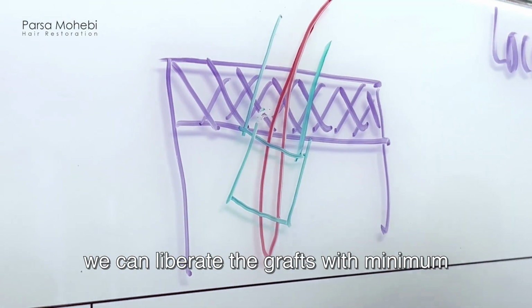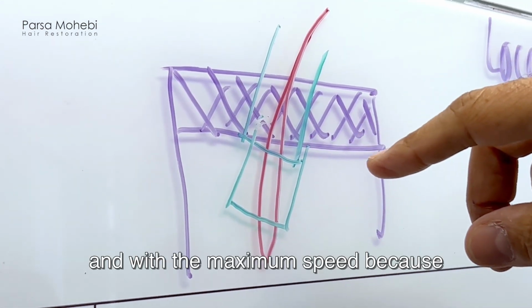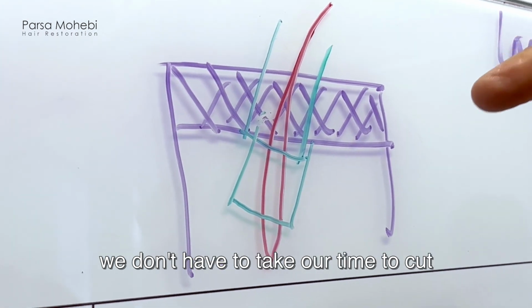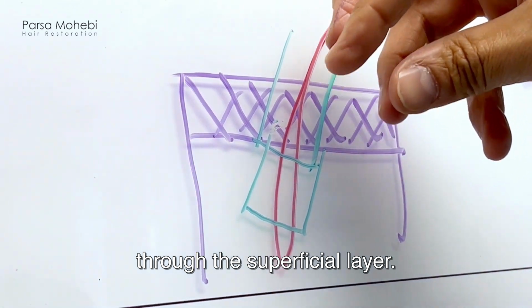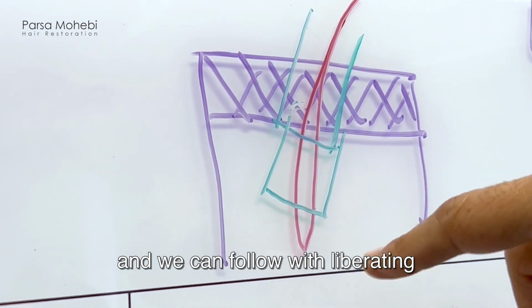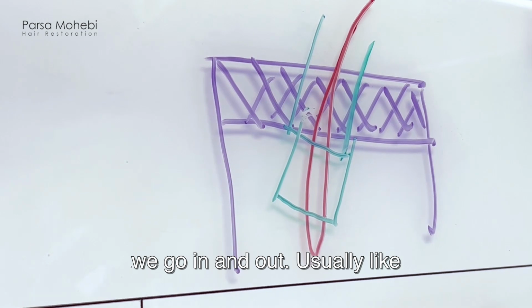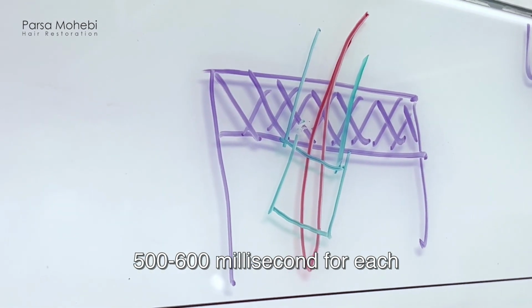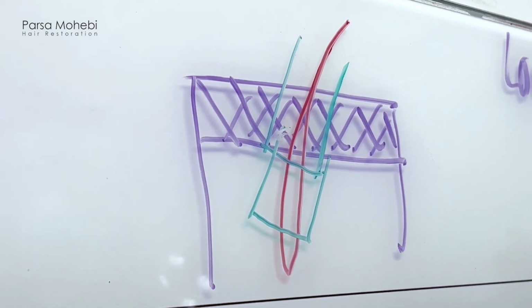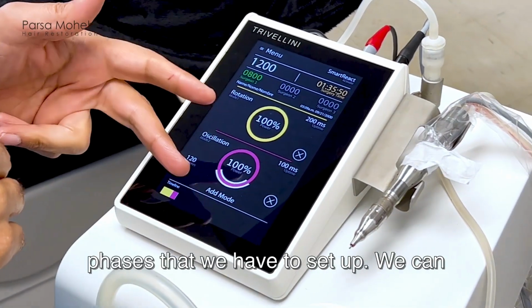So we can liberate the grafts with minimum damage to the hair follicles and with maximum speed, because we don't have to take our time to cut through the superficial layer. The superficial layer can be cut very fast, and we can follow with liberating the grafts as fast as the first phase. So we go in and out, usually like 500, 600 milliseconds for each extraction of grafts.